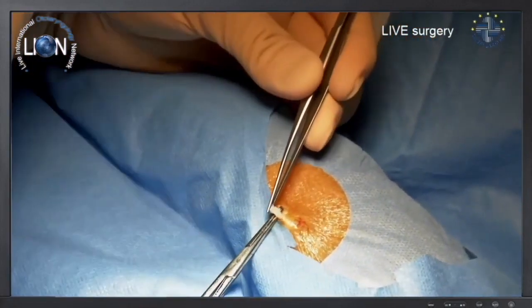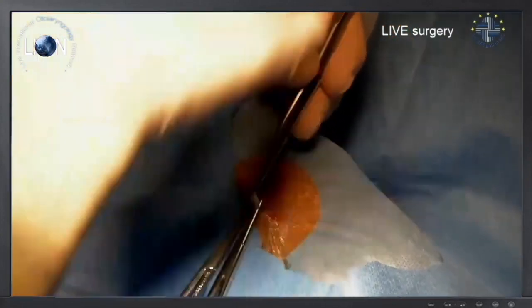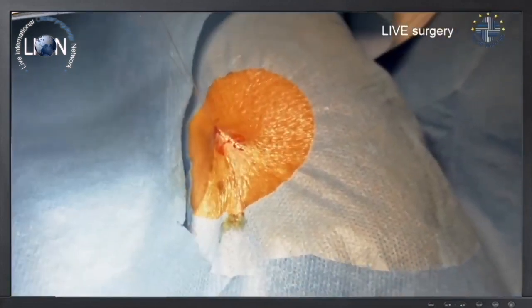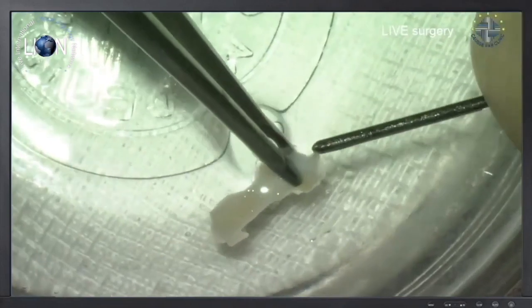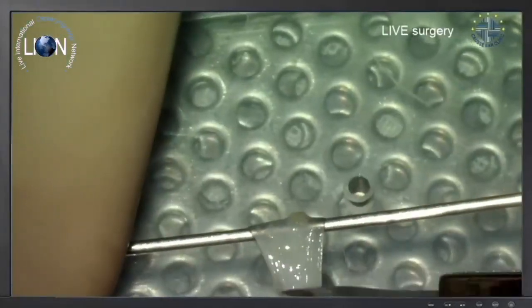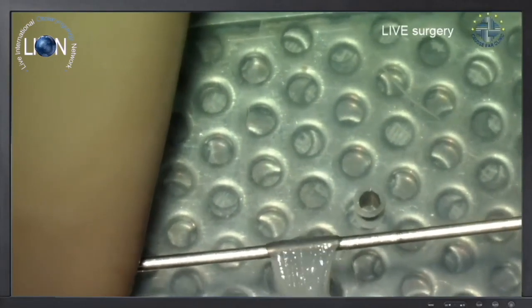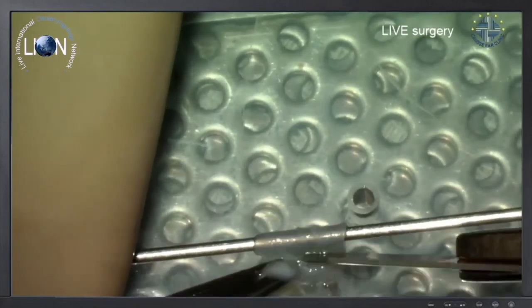So I like to use a vein because I like the fact that the vein is very thin and very elastic. So we got the lateral side of the vein, which is the sticky side, connective face of the vein, and then the adventitial side, and the inside is the intima. So I'm going to pre-shape the vein like this, removing the perivenous connective tissues from the lateral side of the vein to make the vein thinner.